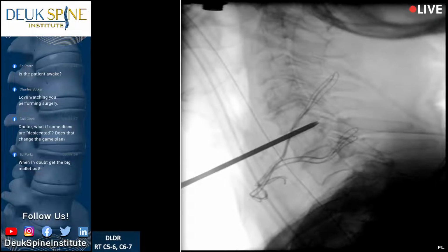Now, folks, can you see this, Flynn? Hopefully you can. We're going to do the whole surgery through this tube. We made one incision, and I've just moved from one disc to the next. So this patient's having two herniated, degenerated discs fixed with one little 4mm cut. The blood loss in this surgery is almost zero. It's minimal. It's a few cc's of blood loss.